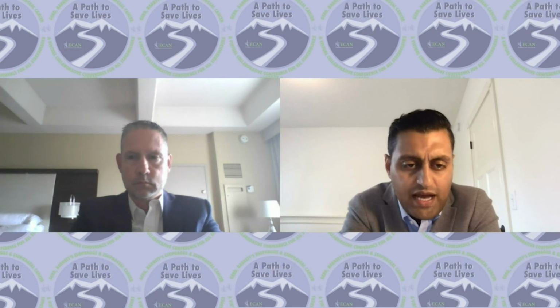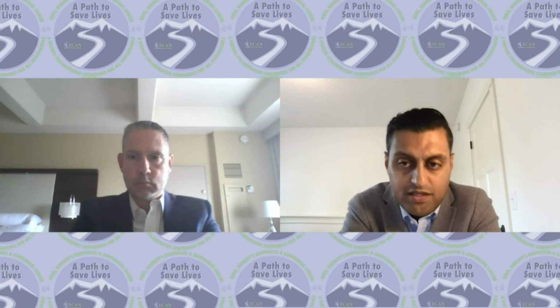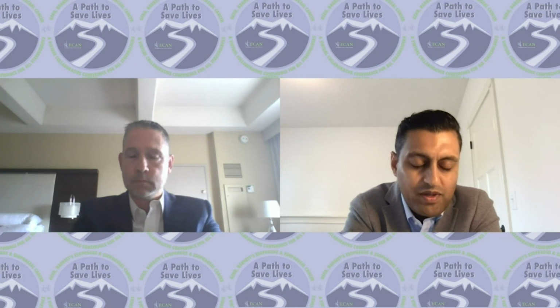For cryoablation, I would expect patients to experience a relief in their dysphagia after about 2 to 3 sessions typically, and I bring them back at an interval of about 2 to 4 weeks. And I know Tufik, if I can speak for him, he also does the same thing at CTCA. So being a little bit aggressive up front, we'd expect that we should be able to palliate their dysphagia within a 2 to 6 week period.